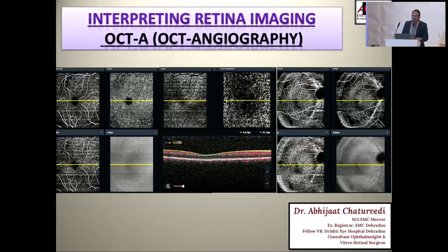Why I chose to speak just on OCTA: I feel that just like suprachoroidal injections, OCTA is an underdog in the field of investigative retinal diseases. OCTA is very important, a diagnostic tool and a patient education tool, and can be used in various diseases which include neovascularization. I'll just show you that.